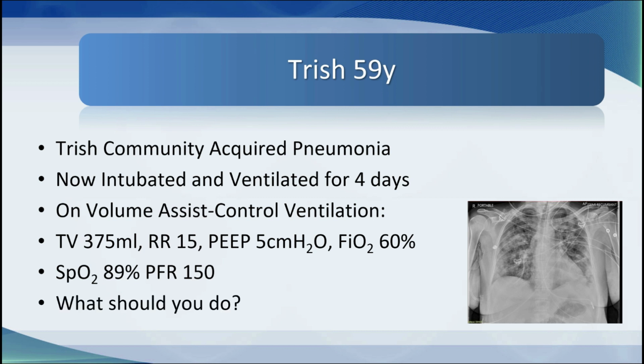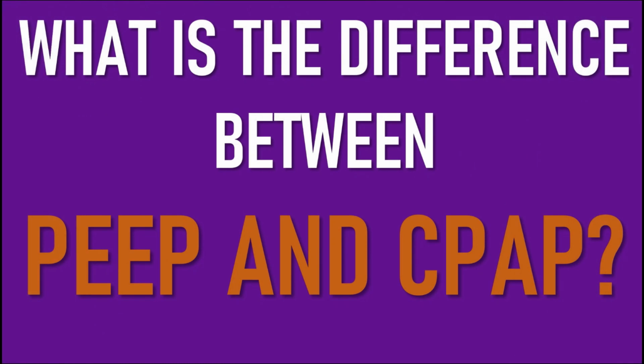Well, in both these cases, we are going to either deliver or adjust her airway pressure at end expiration. And what we're going to do is we're going to give Magella CPAP and Trish more PEEP. So let's just look at the difference between PEEP and CPAP.